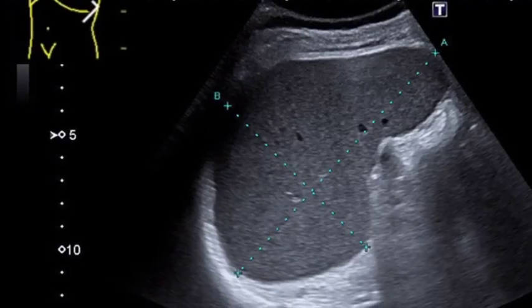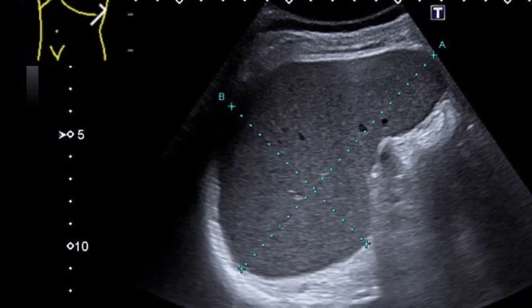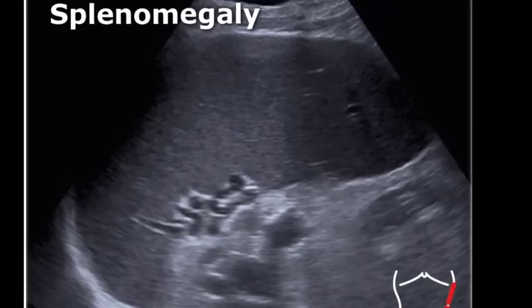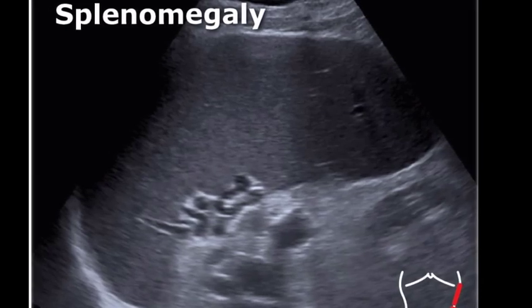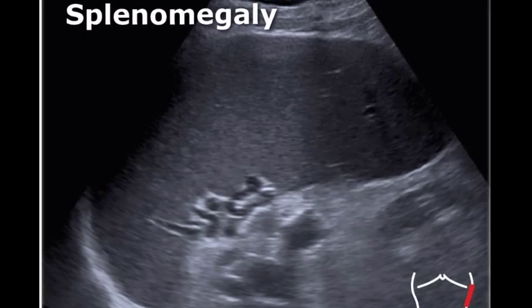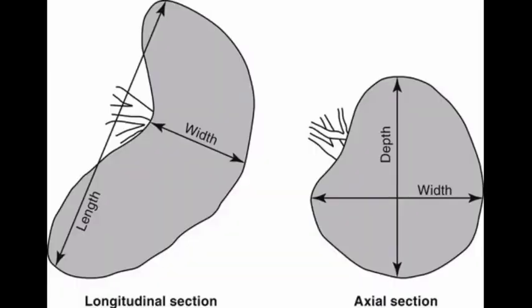Ultrasound appearances of the spleen. The spleen has a homogeneous appearance. When it becomes enlarged, it loses this shape and, as it expands, it becomes very rounded, sometimes appearing to extend beyond the left kidney. Normal adult spleen size: less than 13 cm, superior to inferior axis.